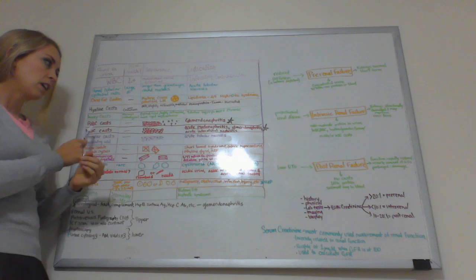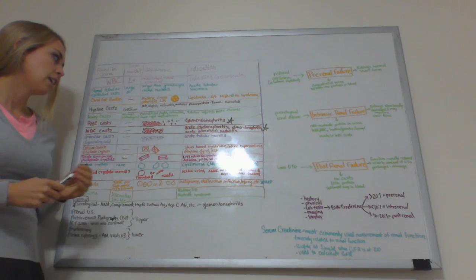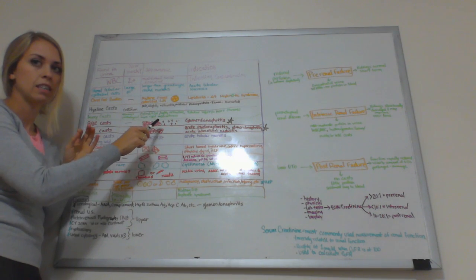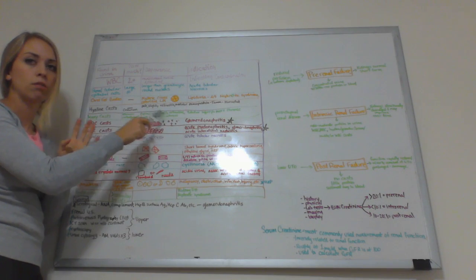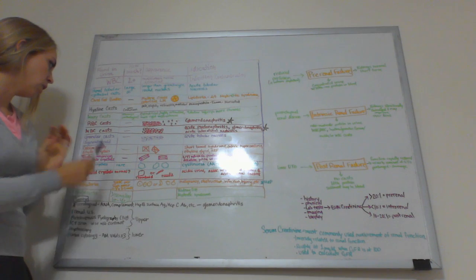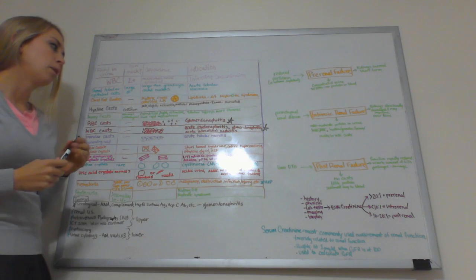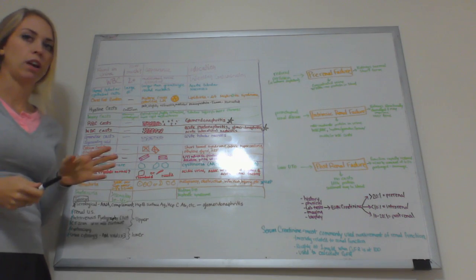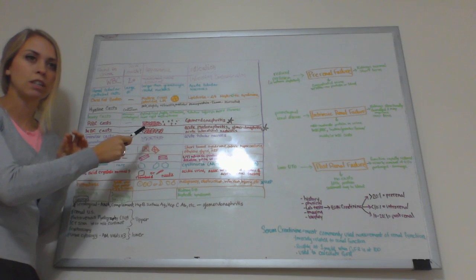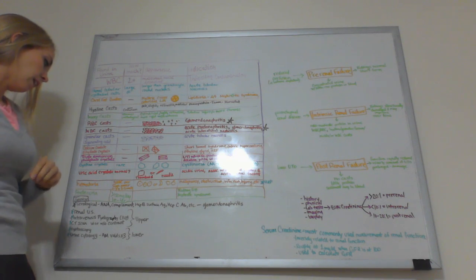If you find red blood cell casts, you would think glomerulonephritis, and it appears something like this. You'd have very malformed red blood cells in a cast, and you'd probably see other single red blood cells with it, not just the cast. And then white blood cell casts, you would also think glomerulonephritis, but most likely it would be acute pyelonephritis. Those casts look a lot like the red blood cell cast, except they would be larger because the white blood cells are larger than the red blood cells.